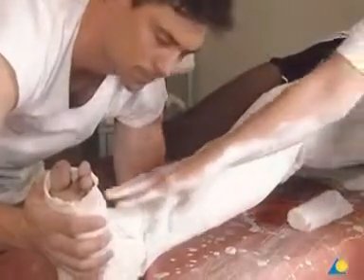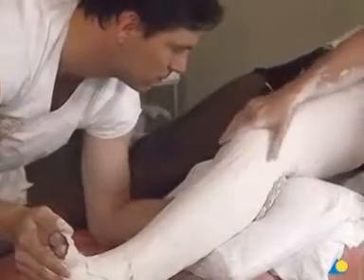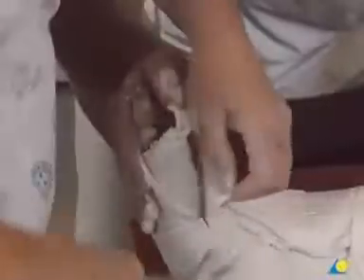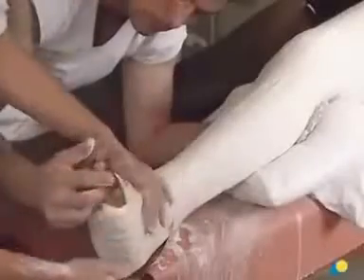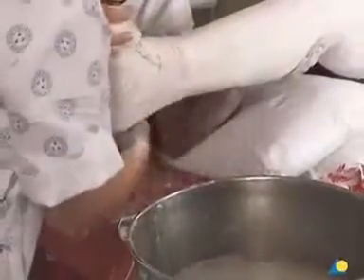A pillow may now be placed under the patient's leg, although the knee should continue to be supported. The extra plaster covering the toes should be noted; this ensures that there will be adequate support for the metatarsal heads. The excess plaster is removed with the scissors and the stockinette folded over the distal end of the cast. Another plaster bandage is used to secure the ankle and the loose end of the stockinette at the distal edge, applied in a figure of eight around the ankle.